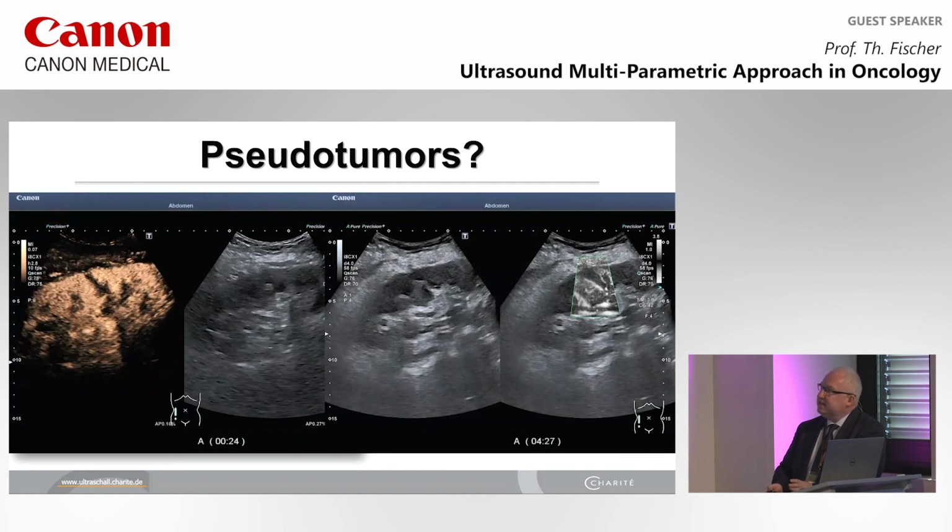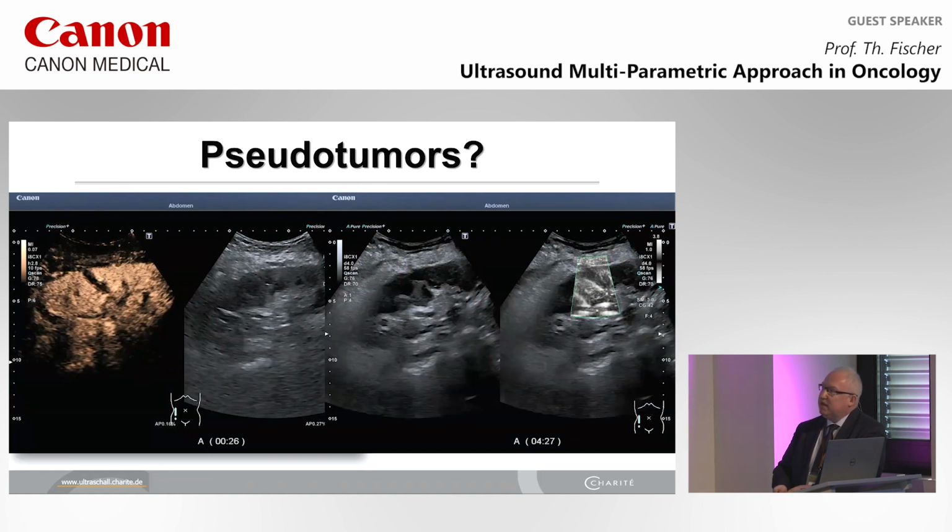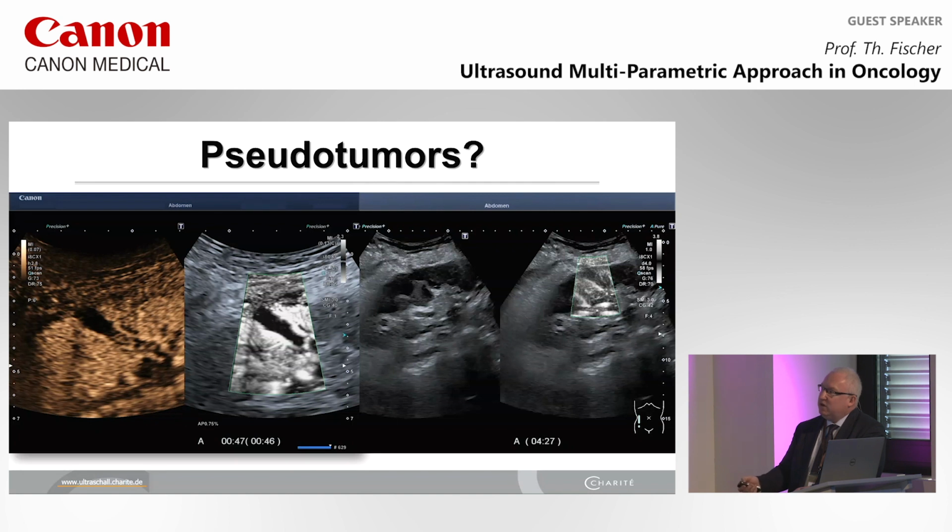And now, interestingly for me, if we look at the SMI Doppler, we can pick up the same thing in its high quality, and that's really nice. We can use the adaptive SMI without contrast media application to understand this must be an infarction zone. And so this is a really helpful tool, in my opinion, for our daily business.